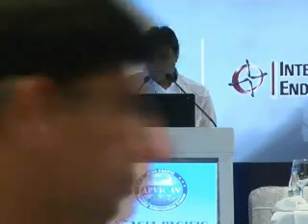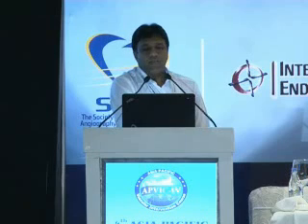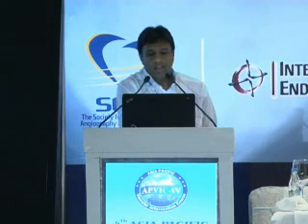These are the different sizes of the balloon, and these are the stents. After every angioplasty, there is no need of putting a stent in every lesion. The vascular stents are metal frameworks that support the lumen from within. The types of stents are self-expandable, as it is self-explanatory. As soon as it comes in contact with the blood, it expands. Then balloon expandable, bare stent, covered stent, and drug-eluting stent.